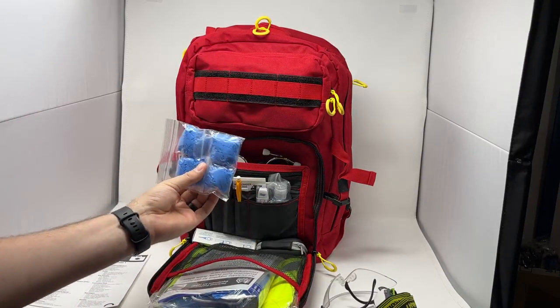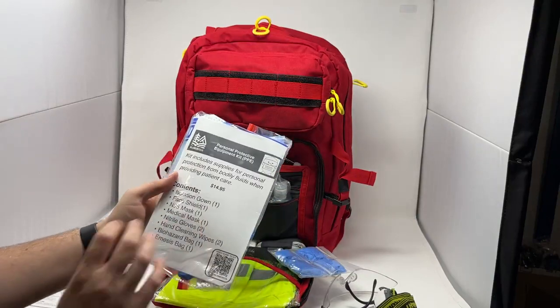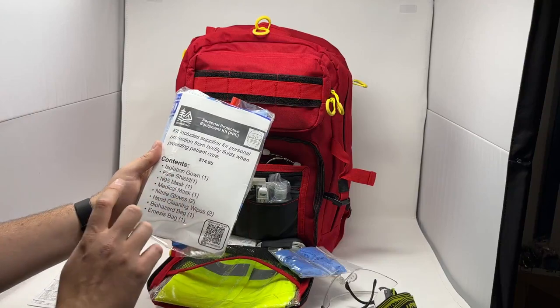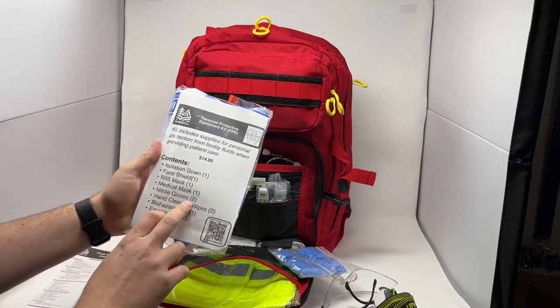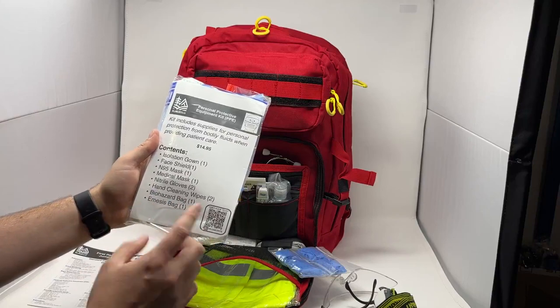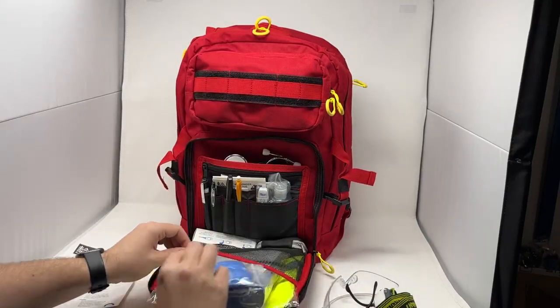We have four pre-packed pairs of gloves, as well as our fully pre-packed personal protective equipment kit. This comes with your isolation gown, a face shield, an N95 mask, a medical mask, another pair of gloves, two hand cleansing wipes, a biohazard bag, and a vomit bag. That's a great little kit for any personal protective needs.